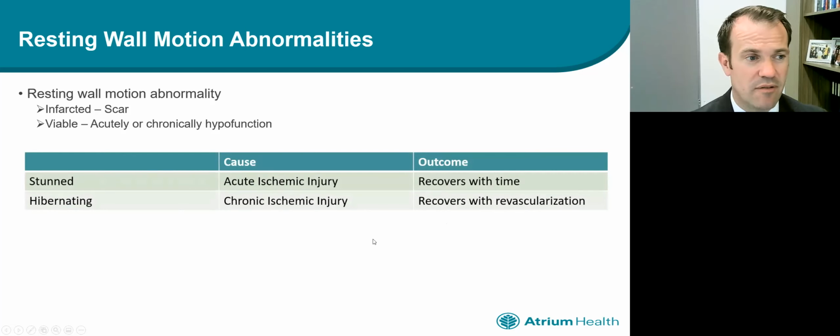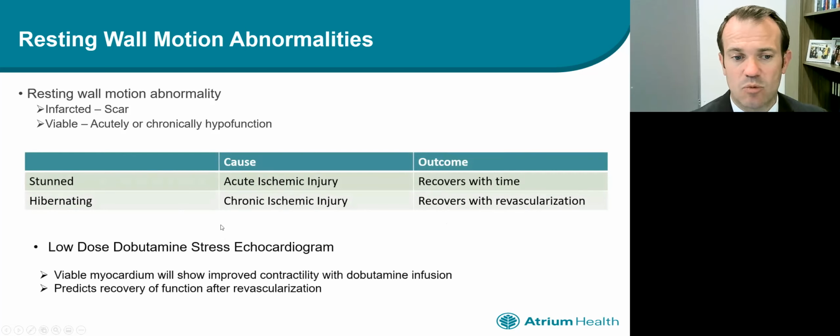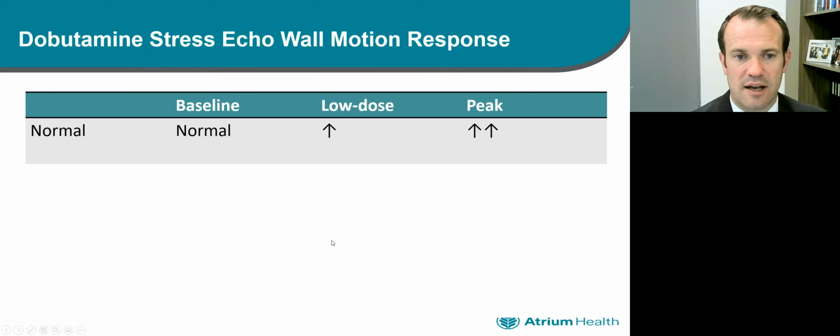So this is obviously very important to know, and we will use low-dose dobutamine stress echocardiograms to define whether the myocardium is scarred or whether there is viable myocardium there. And this does predict recovery after revascularization.